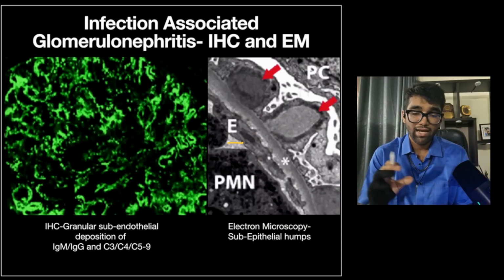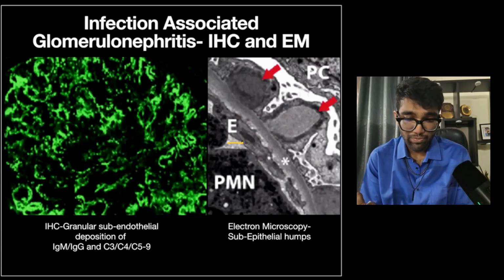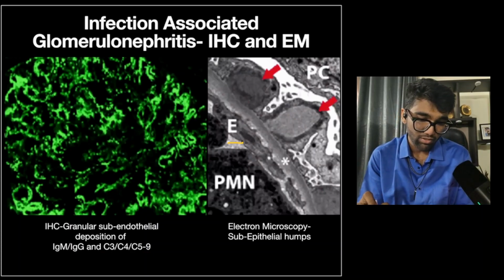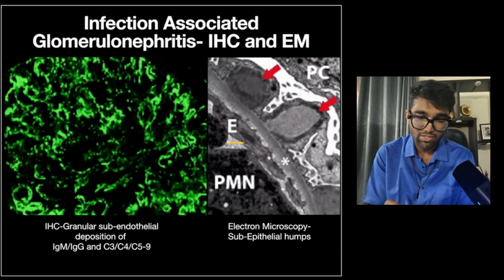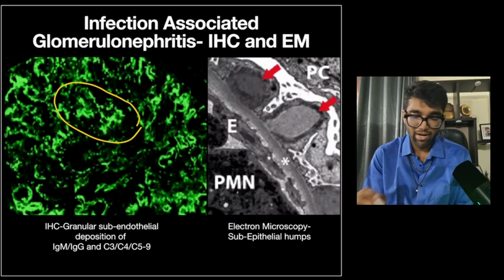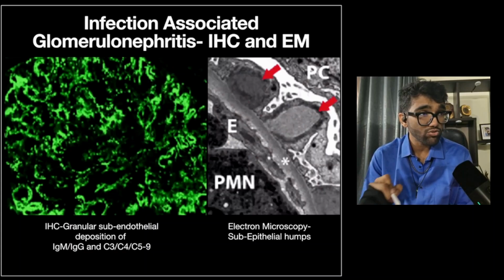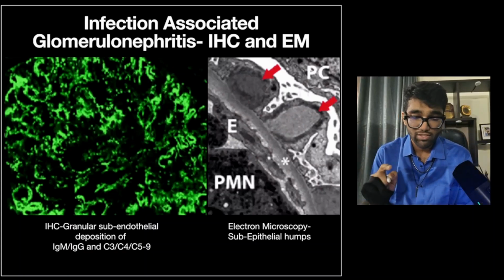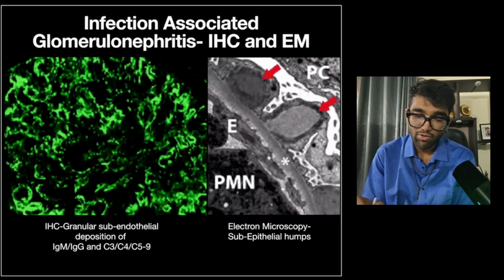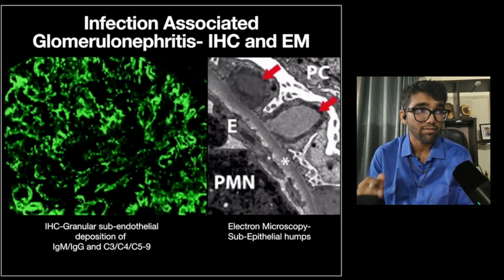But the antibodies, when you look at it under the microscope, are getting deposited subepithelially, and if you recall, because this is subepithelial immune complex deposition, the granular pattern is also not showing a pseudo linearity. So it is not showing one edge of the granular pattern that is extremely well demarcated, because the outer edge is not abutted by the basement membrane.